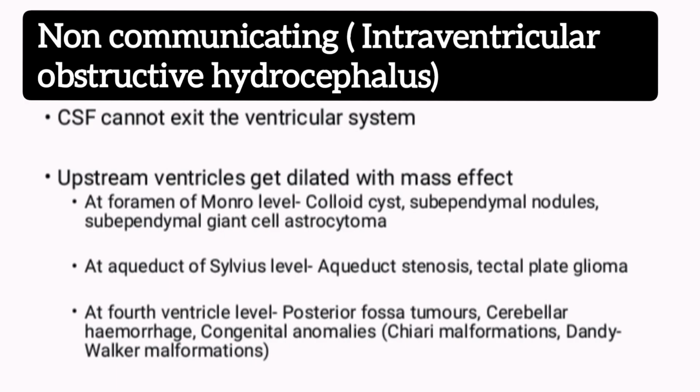At the aqueduct of Sylvius level, aqueduct stenosis and tectal plate glioma. At the fourth ventricle level, posterior fossa tumor, cerebellar hemorrhage and congenital anomalies such as Chiari malformations and Dandy-Walker malformations.